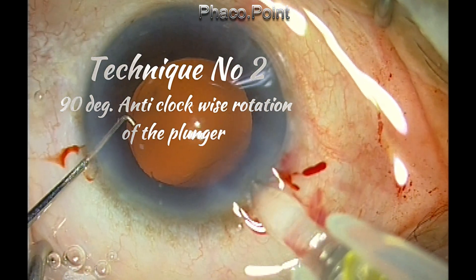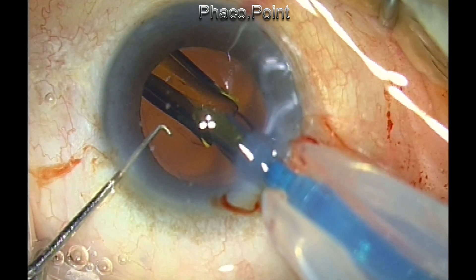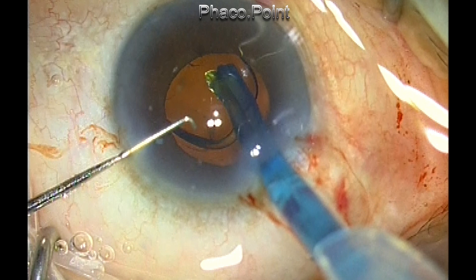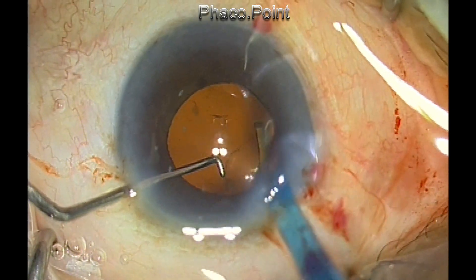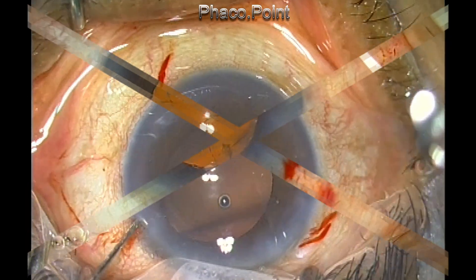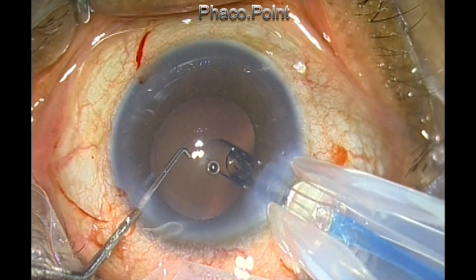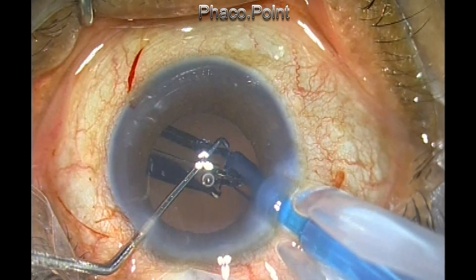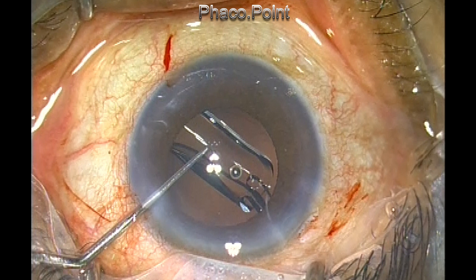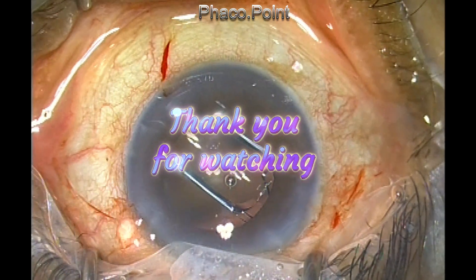There's another technique which also works very well. Once the trailing haptic comes out, you rotate the injector 90 degrees in the anti-clockwise direction and then just press down on the optic. This will cause the haptic to go inside the capsular bag. So once the leading haptic is injected and the trailing haptic emerges, just turn the injector system 90 degrees — this will cause the haptic to spill out — and pressing the optic will cause it to go into the bag. Thank you for your attention.